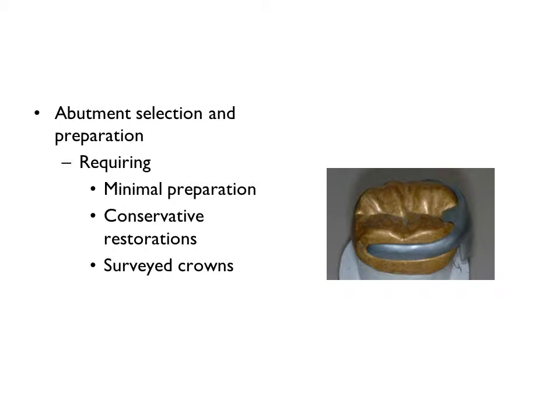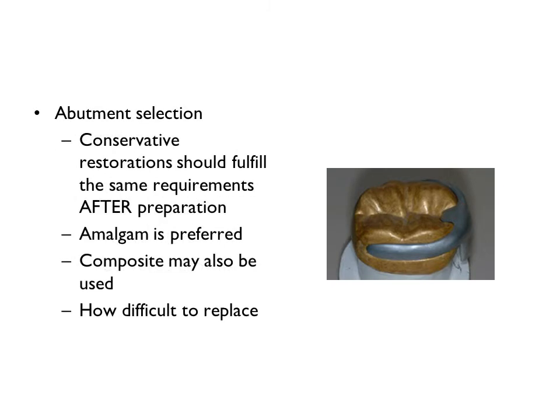1. Teeth that are to be used in their present condition. Teeth to be used in their present condition may be unrestored, or have limited restorations, that are of no consequence to the design of the partial. 2. Teeth that require minimal restorations may be used, but allowance must be made for tooth reduction to obtain rest seats, guide planes, retention and the appropriate height of contour. The restoration should not be compromised by the placement of RPD preparations.